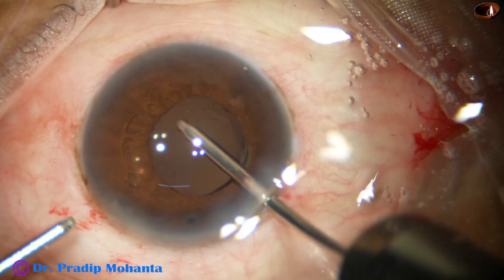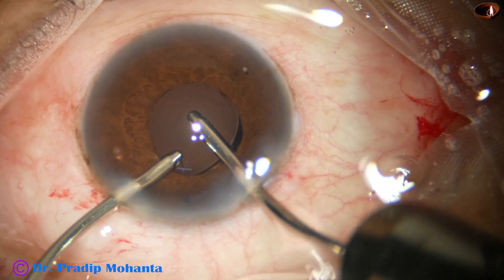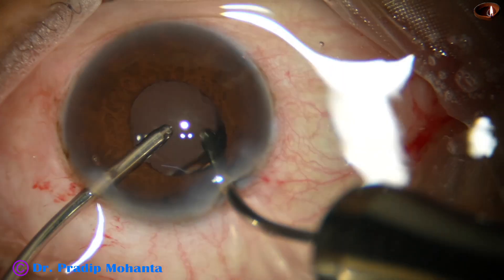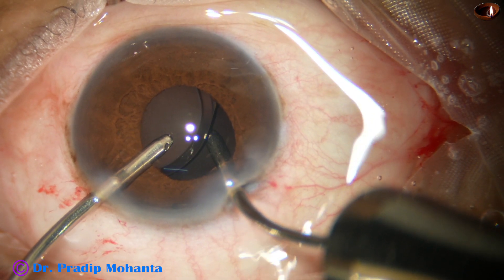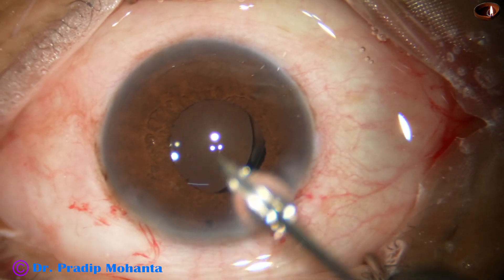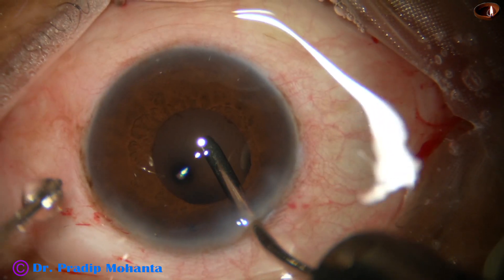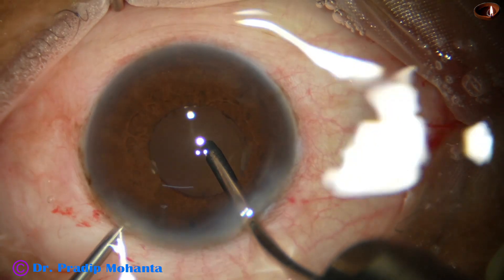Now the irrigating probe of bimanual IA goes in and irrigates the angle. The aspiration probe goes in. Now I irrigate the capsular bag and keep the aspiration probe just in front of the intraocular lens. In this way most of the visco molecules are removed. I find that the lens is not nicely centered, so I rotate the intraocular lens and make it nicely centered.